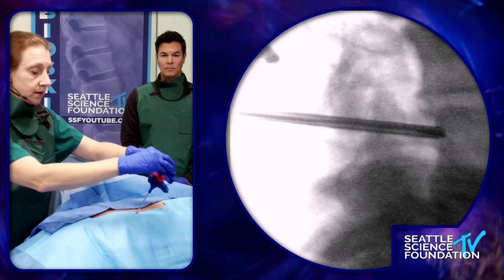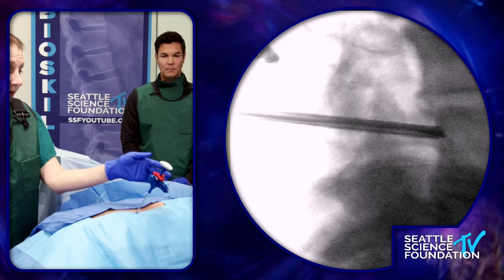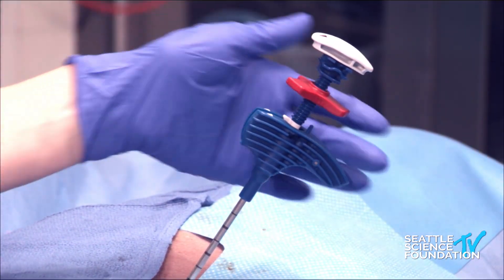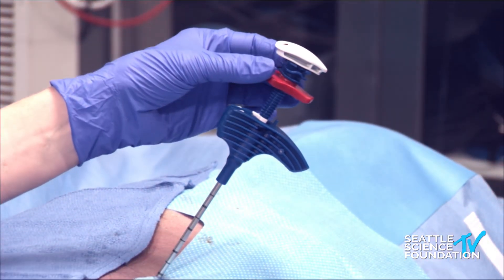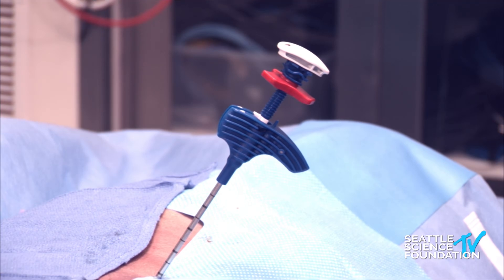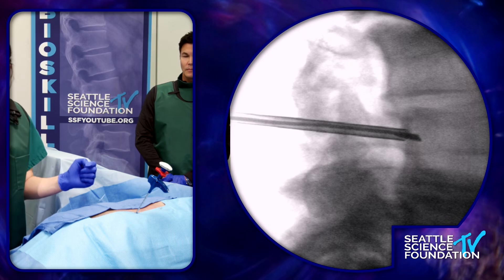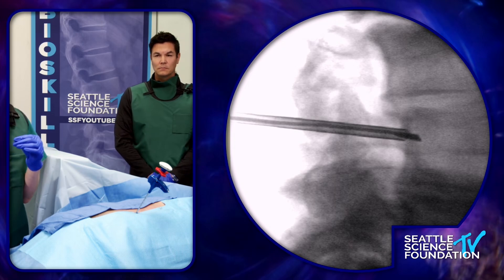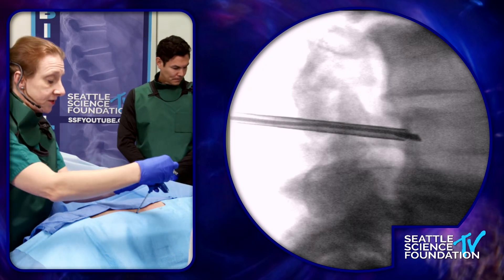Once this is in place, there's a wing nut, and I'm going to elevate it on the threads. This will allow the J tip to come out without obstruction. The wing nut is in assembly down because when it's down, it would disallow you from advancing the J tip beyond the tip of the cannula before you begin using your mallet. You can actually see through the introducer cannula the silhouette of the J tip within it, which gives me an opportunity to do some planning. You can anticipate the trajectory that it's going to take as it advances into the back of the vertebral bone.